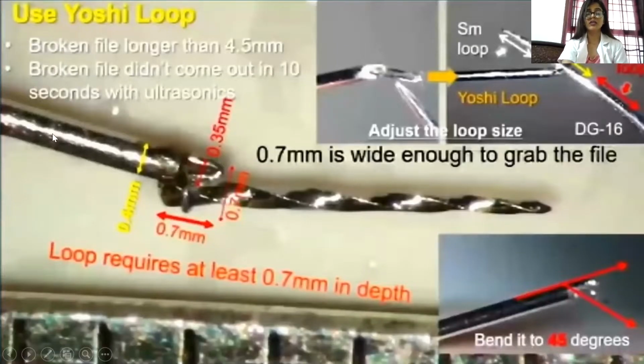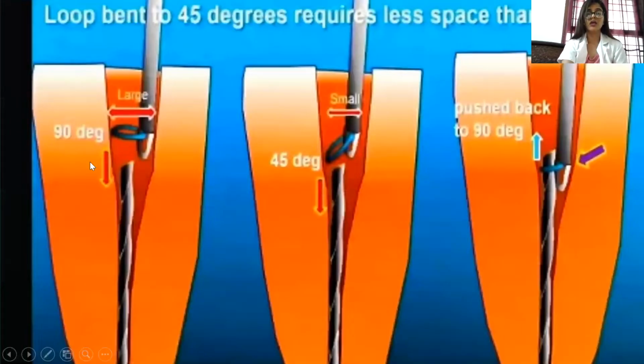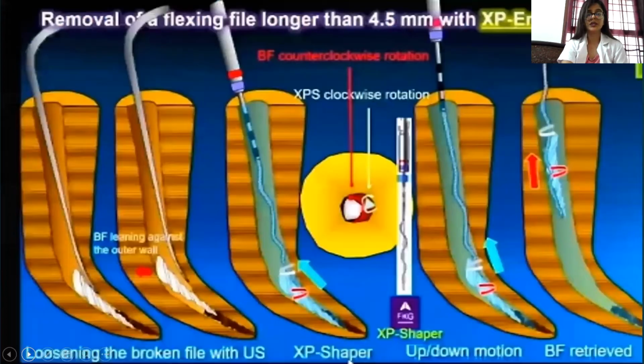Yoshi loop. You can use Yoshi loop with the broken file longer than 4.5 mm or broken file that didn't come out in 10 seconds with ultrasonics. Always bend the loop of the Yoshi file at 45 degrees, then at 90 degrees and remove the broken file. Removal of a flexing file longer than 4.5 mm, you can also use XP endo shaper. Since it has a snake-like motion, that is serpentine motion, it will just vibrate inside the canal and remove the broken file.